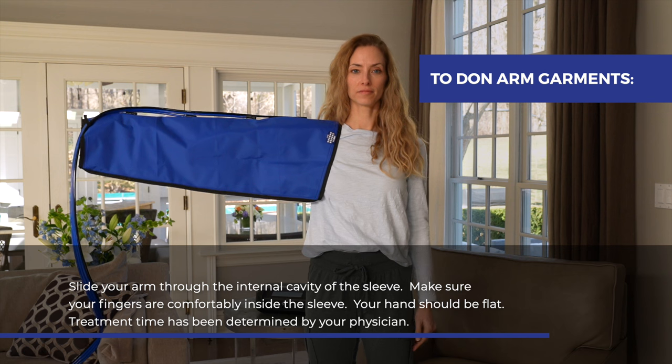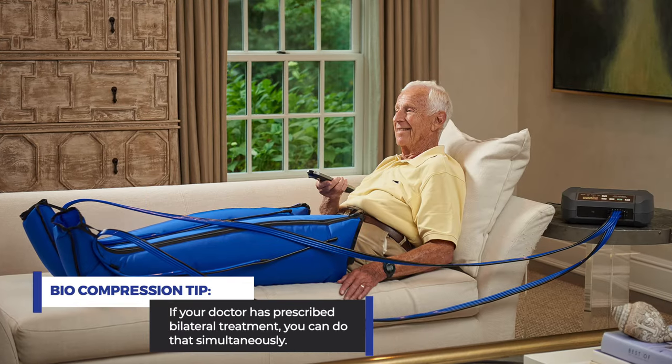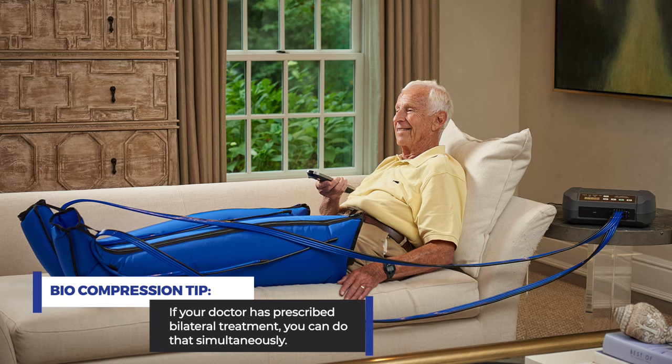Treatment time has been determined by your physician. And remember, if your doctor has prescribed bilateral treatment, you can do that simultaneously.